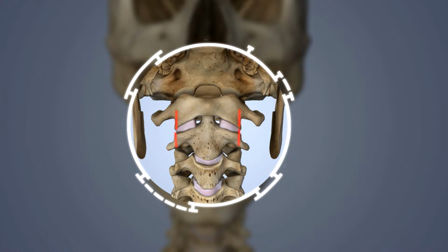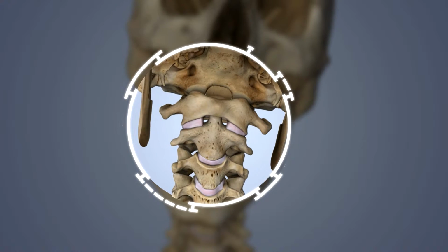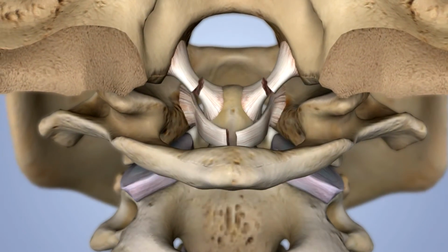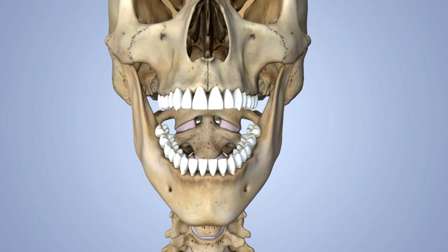Here's that lined up. This is the ligament here. This is the ligament here. Vertebra lined up perfectly. We tilt to the side because the ligaments are fine. They still stay lined up just like they should. But when those ligaments get torn or damaged, you'll see movement where the vertebrae don't line up anymore. So now we're going to show when the accident happens, the ligaments actually tearing, like that. And then we're going to show the motion x-ray again, and the result of that tear is movement that was not occurring when the ligaments were intact and normal.